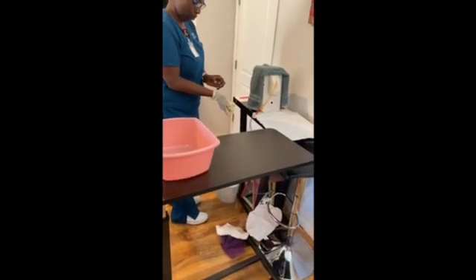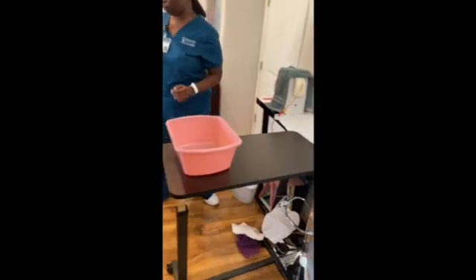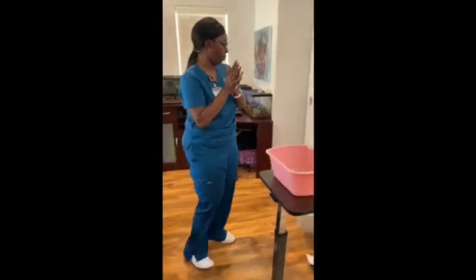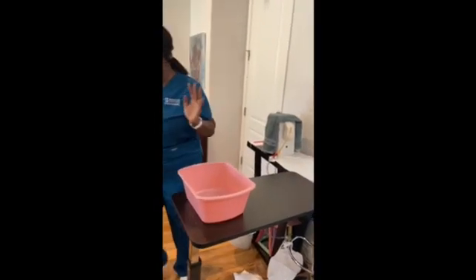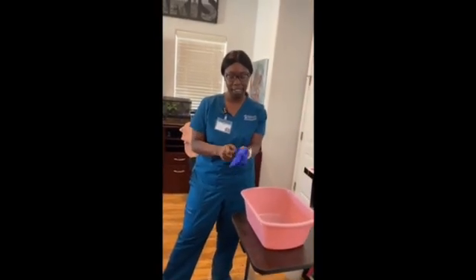I will now don off gloves. Wash my hands. And I am going to put on new gloves since I did not take off the water barrier.